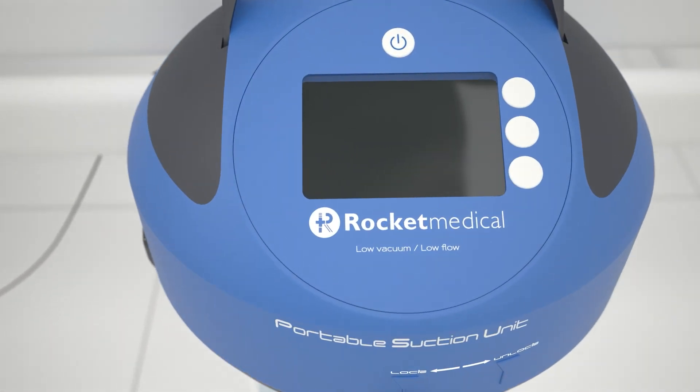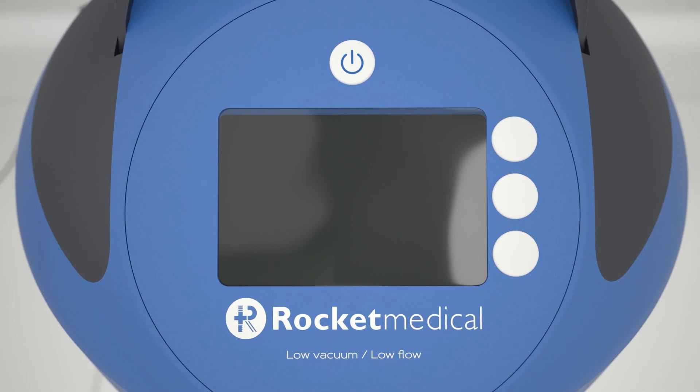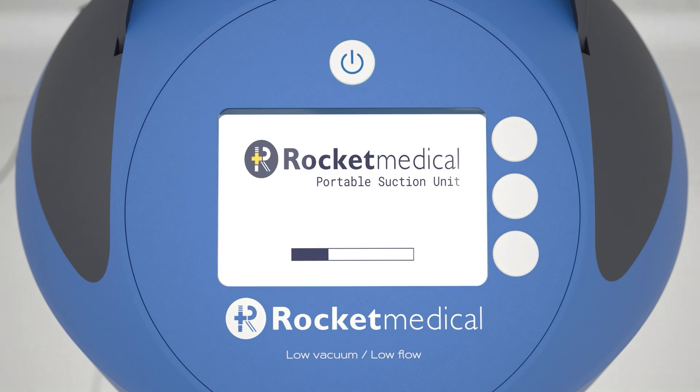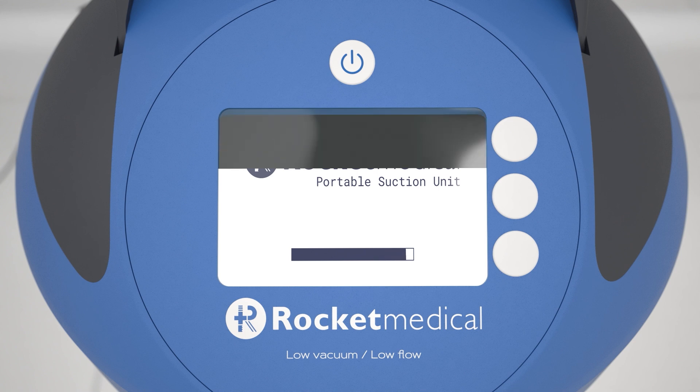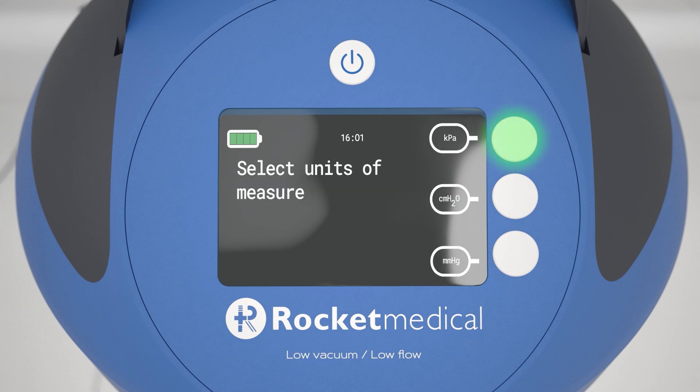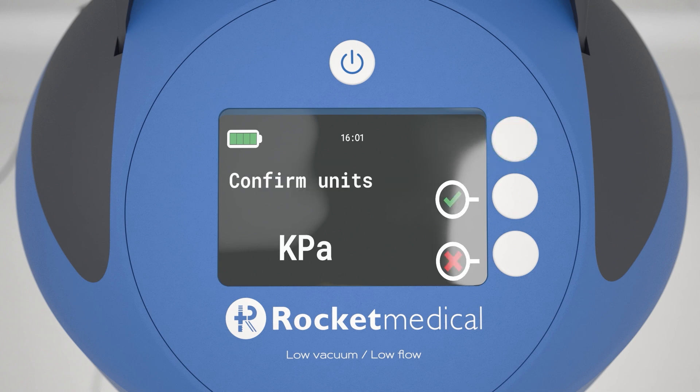To set up the PSU for a new patient, perform the following steps. Turn on the PSU by pressing and holding the on button for more than two seconds. The PSU will begin a self-test. Confirm that the PSU is connected to a new patient and confirm that the PSU filter has been replaced. Select your chosen unit of measurement. The PSU can measure negative pressure in kilopascals, centimeters of water or millimeters of mercury.